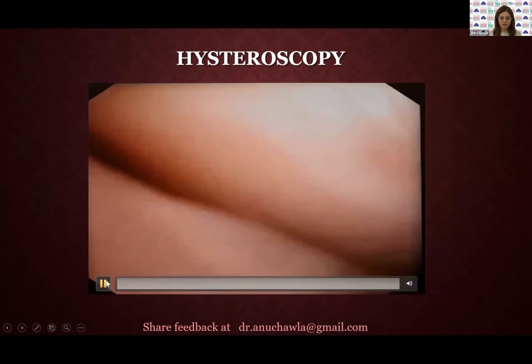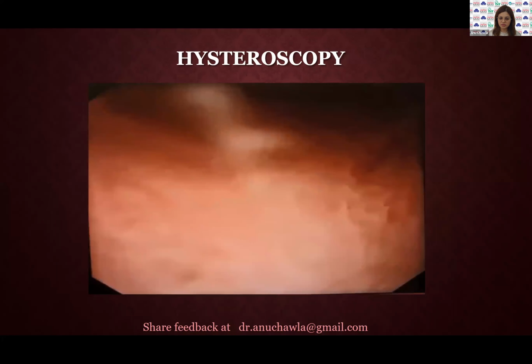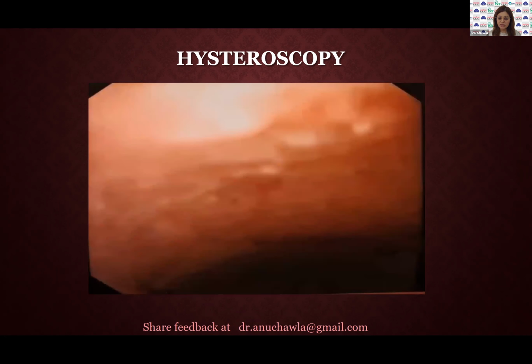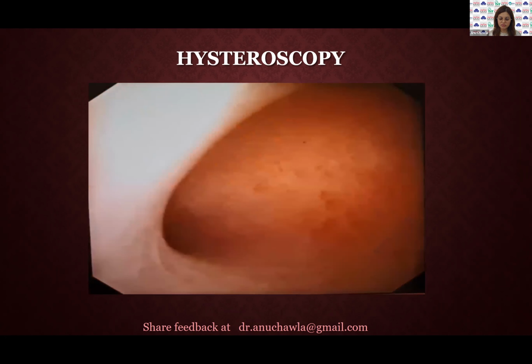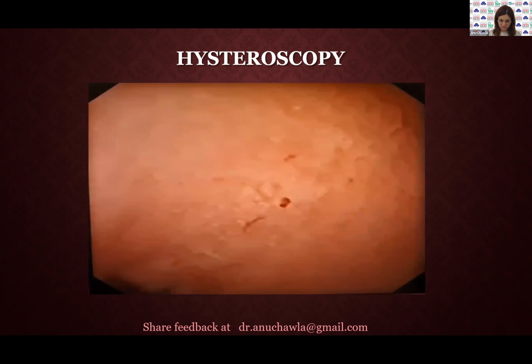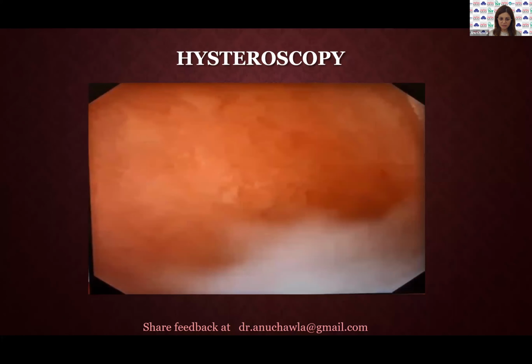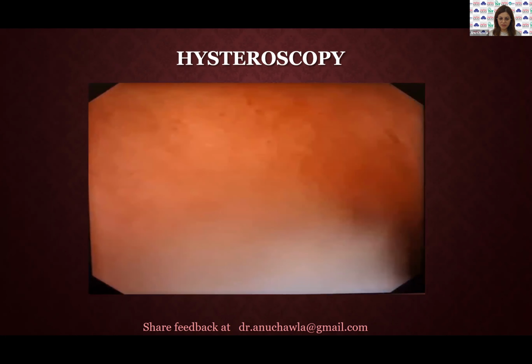by sharing the basic video of an office hysteroscopy. Here we are entering through vaginoscopy. We entered the cervix and now we have entered into the uterus. Saw the panoramic view first. Now we are seeing the right ostium, the left ostium, and then back, and then again the panoramic view of the cavity.